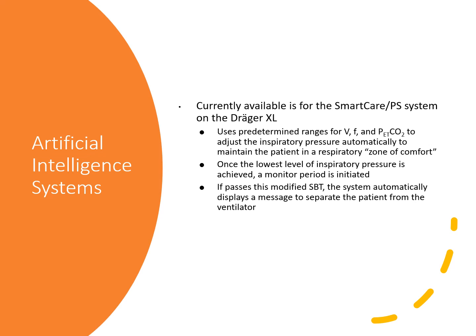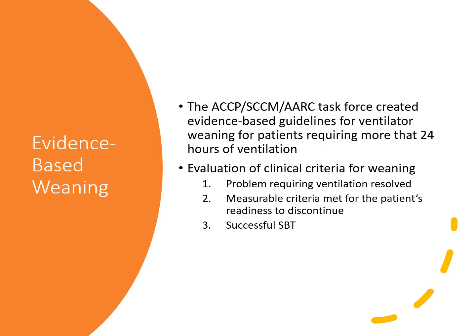So this approach may be a viable alternative because it reduces the duration of mechanical ventilation and ICU days. So the big thing is additional clinical trials here, right? So that will help better define the use of these systems and to ensure the use of them as a highly studied method. So other than that, there's a lot of advantages to this artificial intelligence way of doing it.